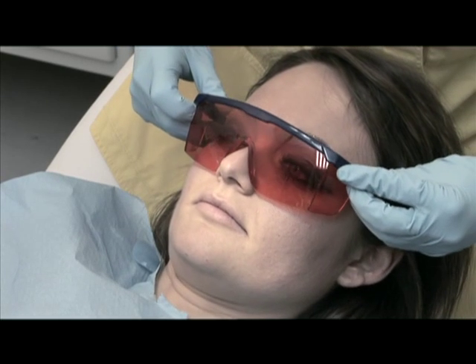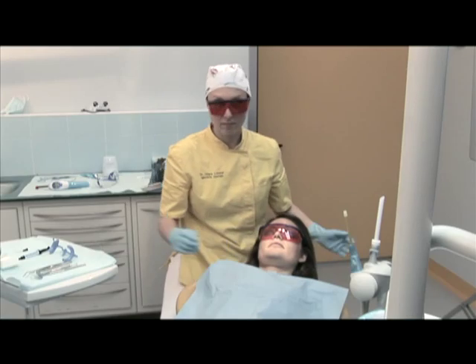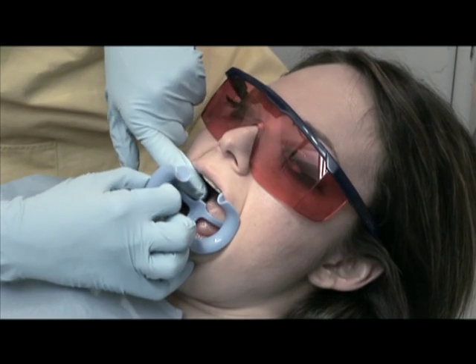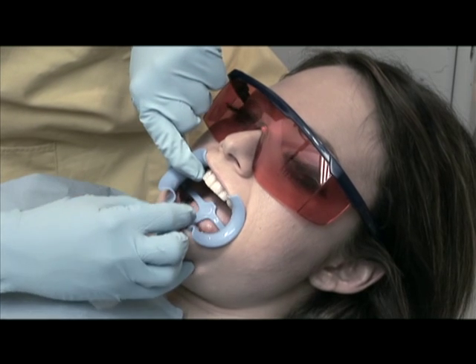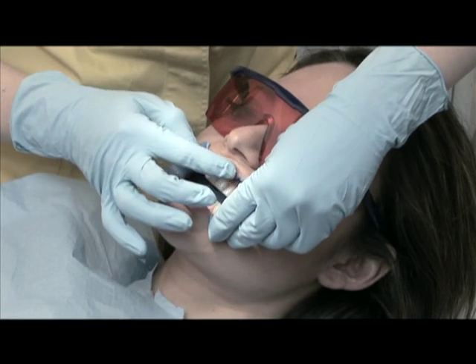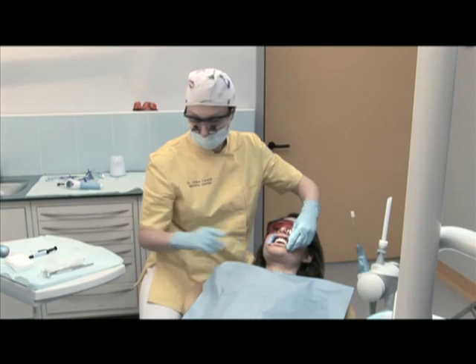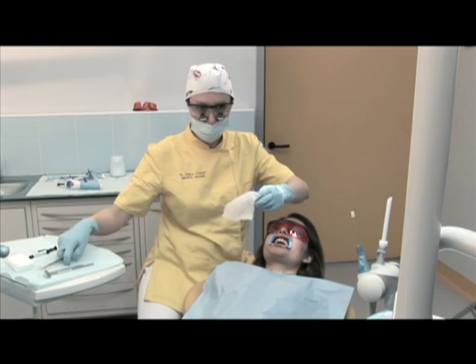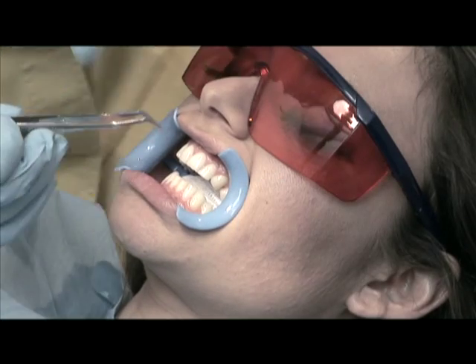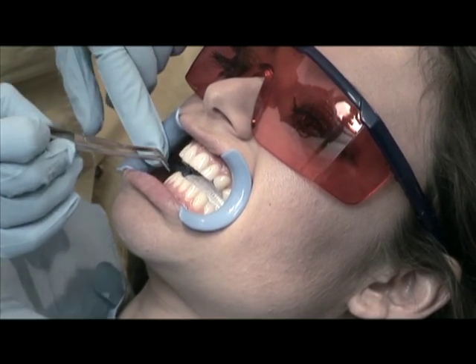Position the light protective goggles and a slightly smaller mouth prop — which may also have a tongue guard — to make the patient more comfortable. Lubricate the lips with some Vaseline or lip balm to prevent them from becoming dry. Place some gauze on the surface of the tongue to protect it against any accidental gel spills.